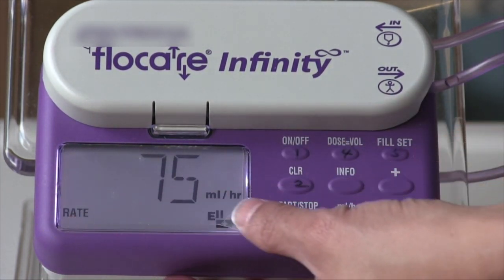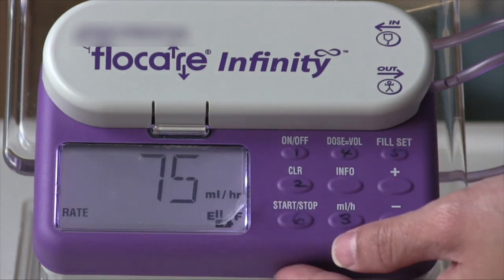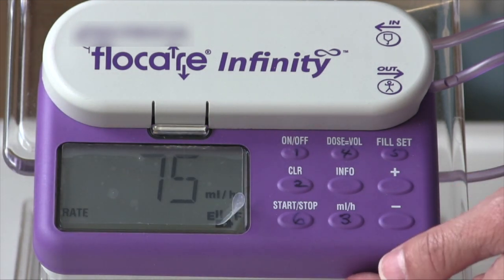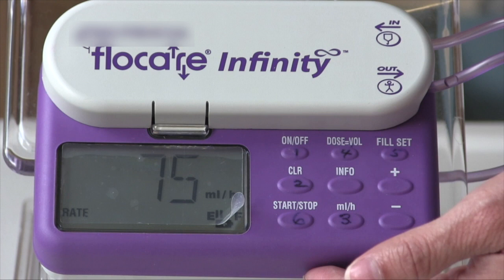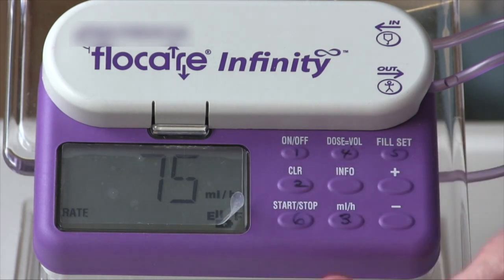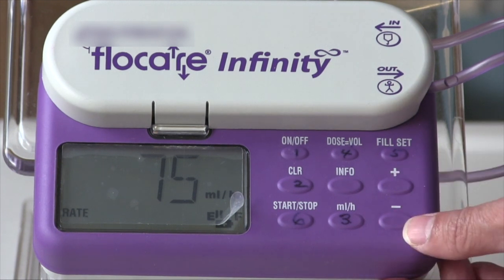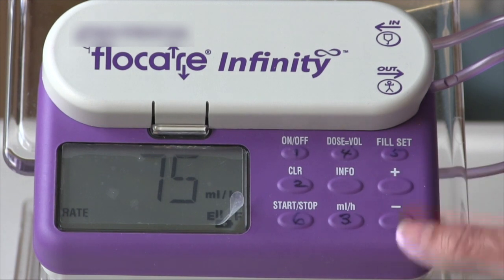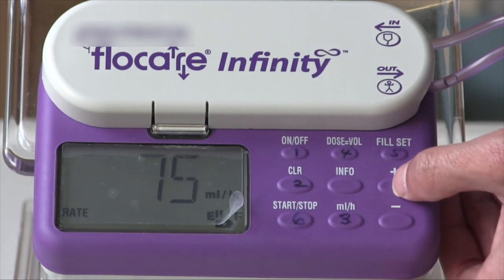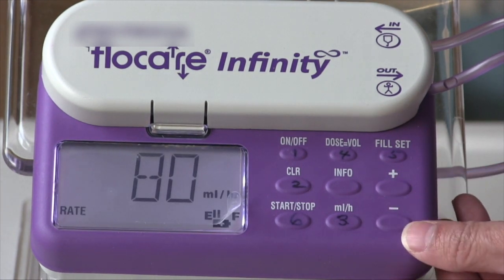Once you completed this, the pump will change to this screen where it says rate. Rate is how fast the feed will run every hour. This will depend on the regime you and the dietitian have agreed on. For this video example, we will set the rate at 80. To adjust the numbers, use the plus and minus buttons. To increase the number, press the plus button, and to decrease the number, press the minus button. So to go to 80, we'll do the plus sign. You can press and hold it down. If you've gone past, you simply press the minus sign.